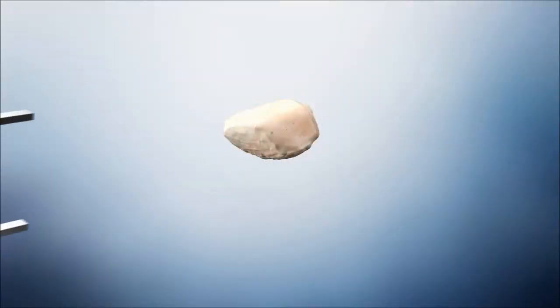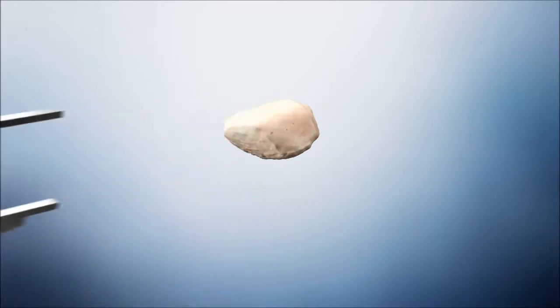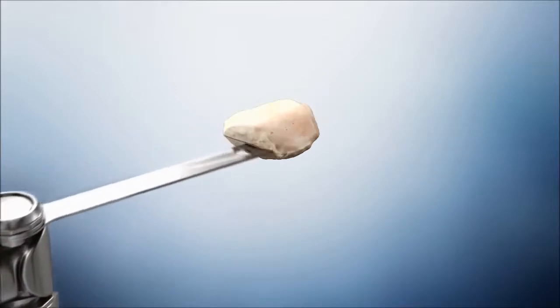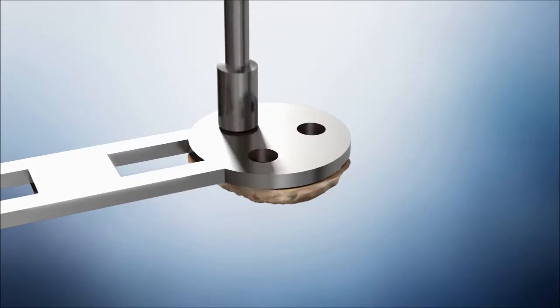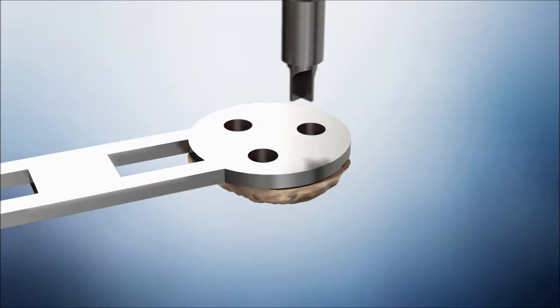Assess patellar thickness. Make the appropriate patellar resection. Position the patellar template that most adequately covers the prepared surface along the horizontal axis of the patella and firmly engage. Drill the 3 holes for the fixation pegs of the component.